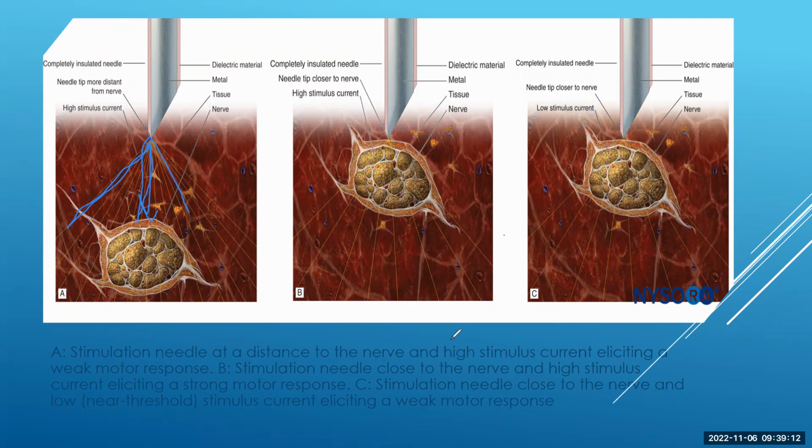And then at that point, we can inject local anesthetic, with frequent aspirations, at 5 ml intervals. And, again, you have a higher energy as you're approaching the nerve. As you get a really good response, you decrease the energy, and the stimulus and the motor response match. You're lowering the mA, which means it'll be a weaker stimulation. That's all appropriate, and that's all what we predict to happen.